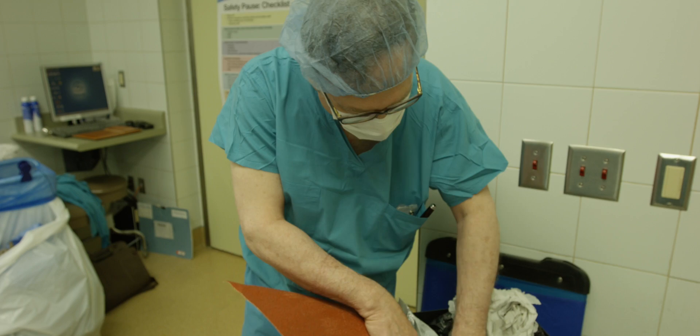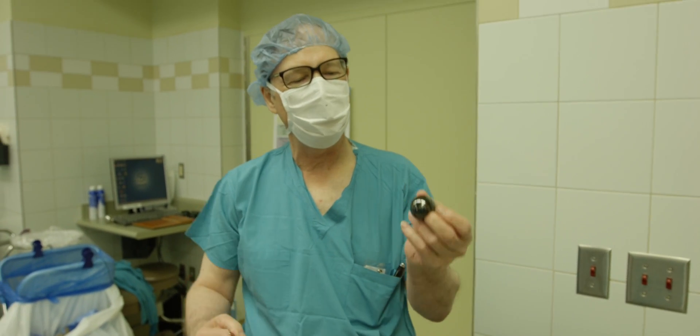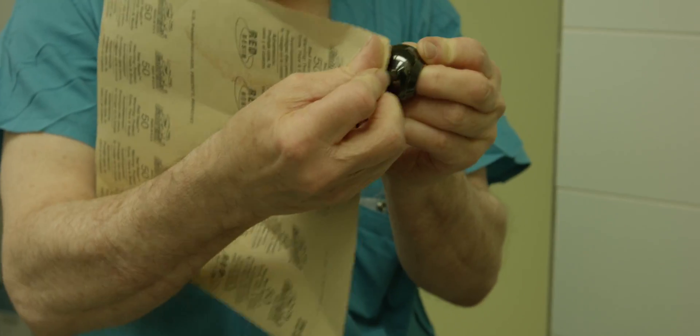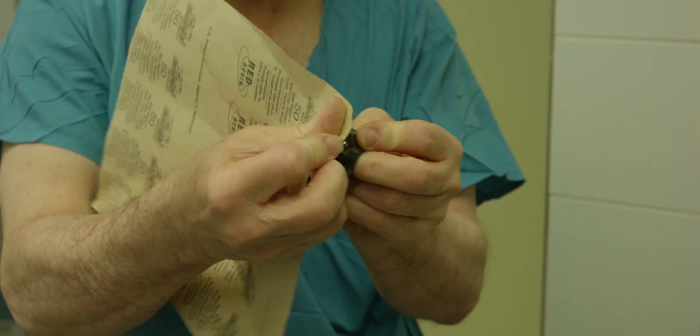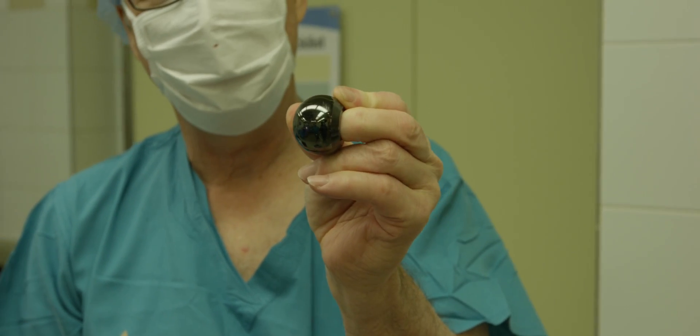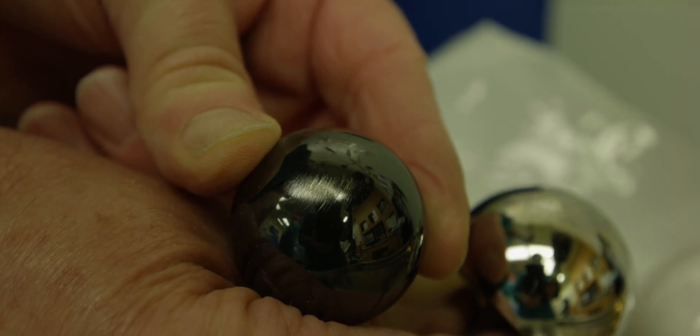And we have it in ball form as well. Here's a femoral head oxinium implant. Sandpaper on it — you can hear it. Again, a very profound scratch that you get from just standard pressure with sandpaper.